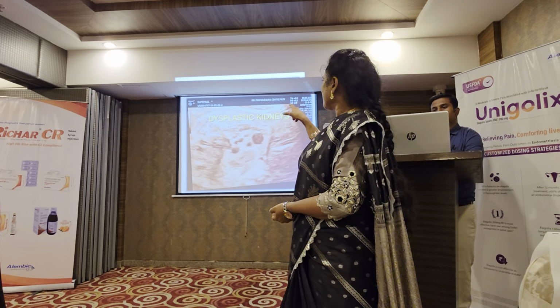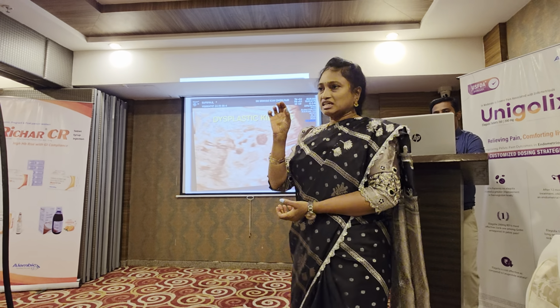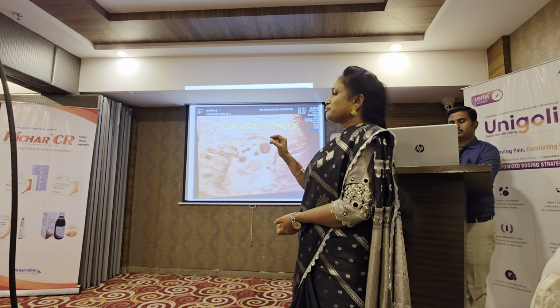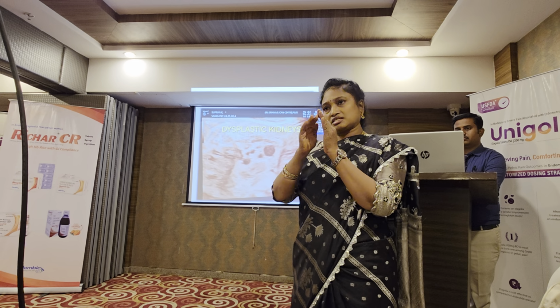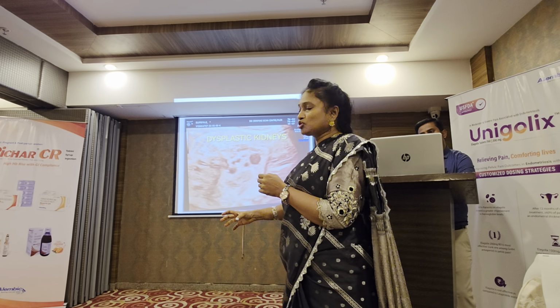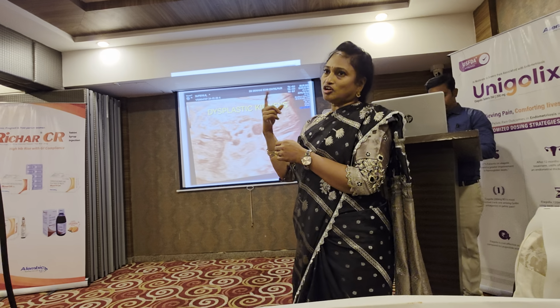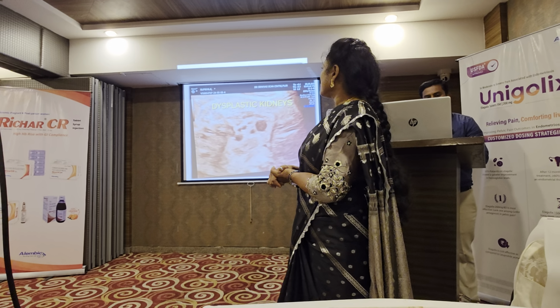Now we come to the kidneys. We finished the thorax. Now we have come to the kidneys. There is a huge dysplastic cystic kidney. Whenever you see kidneys, they should be echogenic, and as it progresses, you see a little bit of mixed echogenicity in both the kidneys. But if there is fluid also, you have to follow up every 15 days to see if the hydronephrosis increases. If there is an obstruction somewhere from the kidney up to the bladder, then the obstruction goes on increasing. In this case, it's not obstruction, it is cystic. Multiple cysts are there. So follow up. If the cyst size increases, it may go on for multiple cystic disorder of the kidneys.